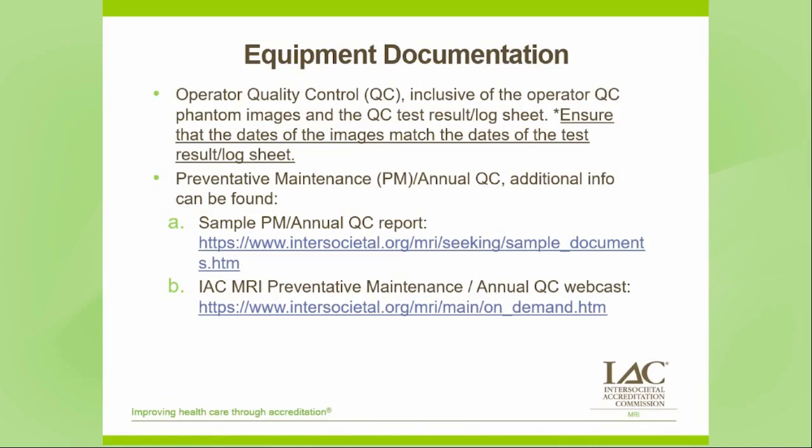So it's very important to check the dates of the QC test results log sheet to ensure that the dates present match the dates of the images that you're going to be uploading. Some facilities even go so far as to write down the dates present on the QC test results log sheet so that they have them handy when it comes time to upload the images.